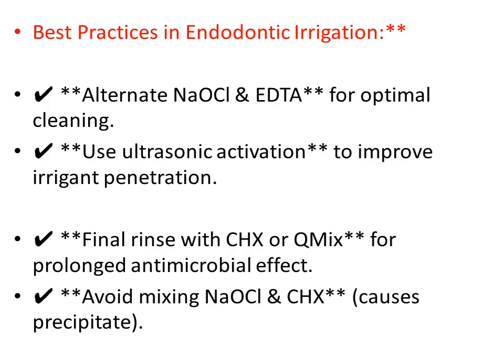with chlorhexidine or Q-Mix for prolonged antimicrobial effects, and avoid mixing sodium hypochlorite and chlorhexidine because they can cause a precipitate.